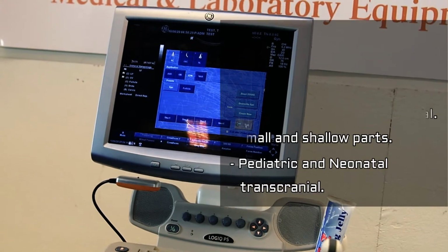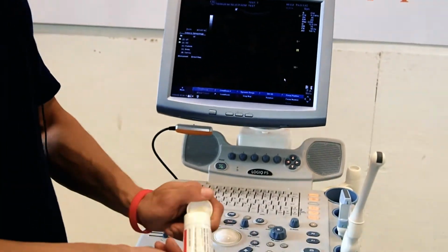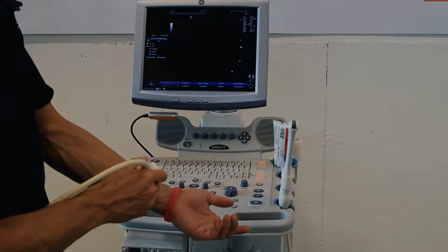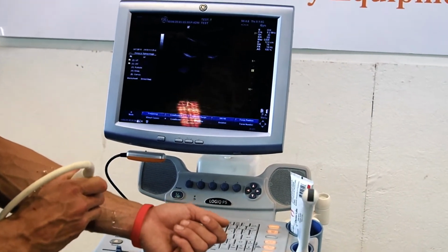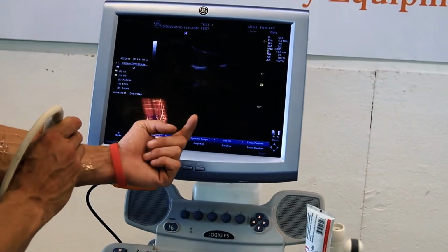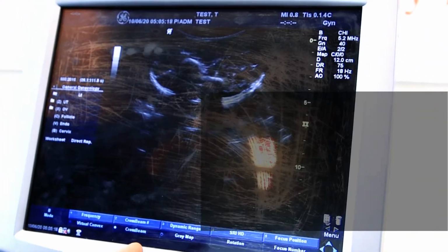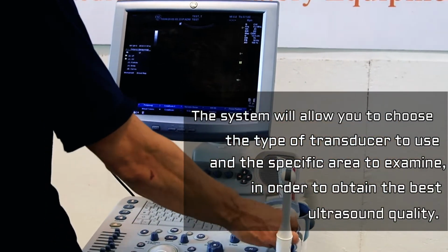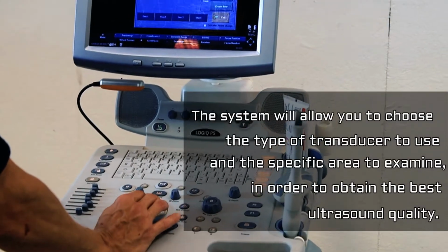Once I have it selected, just go down here, and then at that point in time, of course, you have to have a medium, and we'll take it and we'll use it. Once you have your medium applied, then you can actually use the transducer, and as you can see on the screen here, you'll see all the different capillaries and vascular systems of my arm. Once you're done there, you simply put the transducer back and then change it by hitting the same button. And then you'll come over here.